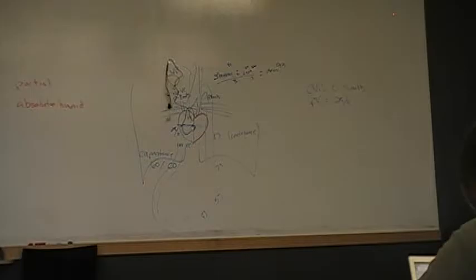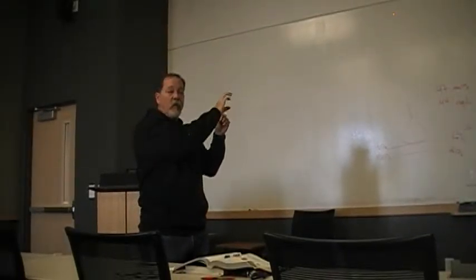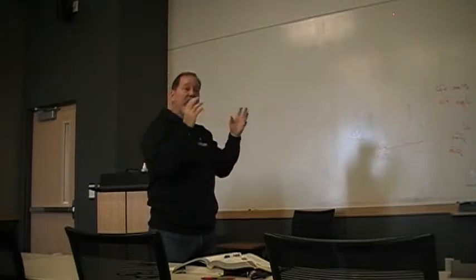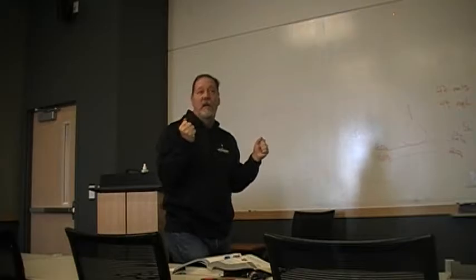But what we'll do, and Hannah, this is particularly important, is that we recognize that these pressures are generating a waveform on the monitor. So we can visually see where the catheter is by what the waveform looks like. And the higher the waveform, the higher the pressure. And so it's visually important to know what the waveform looks like, but behind that waveform are these pressures. Okay. So it'll become evident, I think.